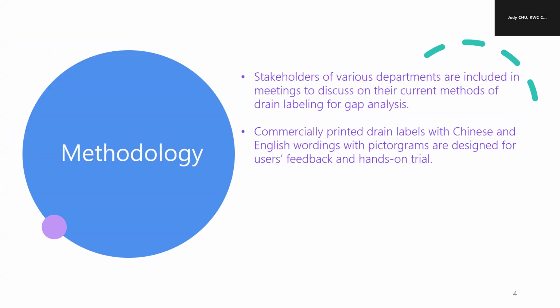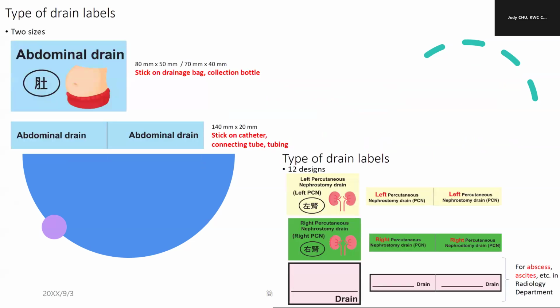We started to gather stakeholders of various departments to discuss their current methods of drain labeling for gap analysis. We then procured commercially printed drain labels with Chinese and English wordings with pictograms, which are designed for users' feedback with hands-on trial. Here are our drain labels.